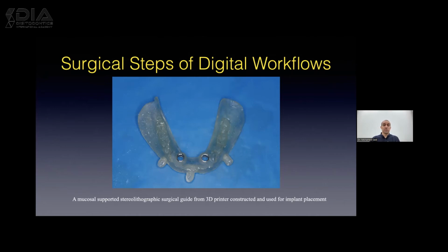So this is one of the cases that we have done here in our dental school by our master students, Dr. Ala and Dr. Nadia, under my supervision and Dr. Salah Higazi, the head of department's supervision. They are doing great work, and they already graduated, and they had very nice cases during their study. This is one of the cases that I'm going to show to you. So we have printed the surgical guide, and now we will use the surgical guide for implant placement.